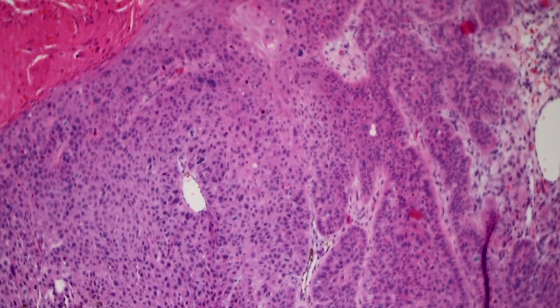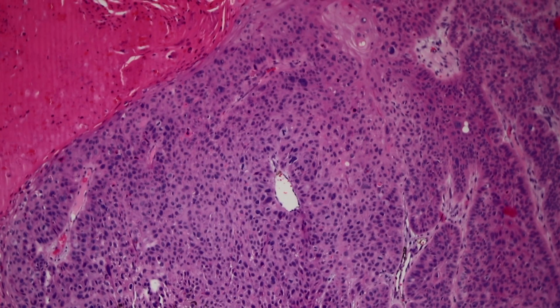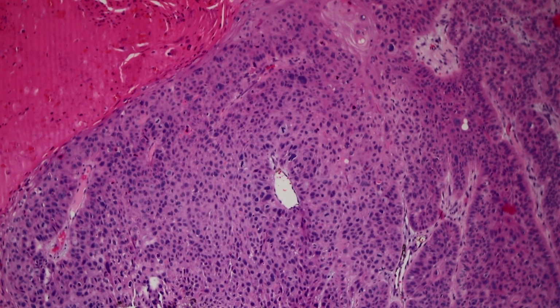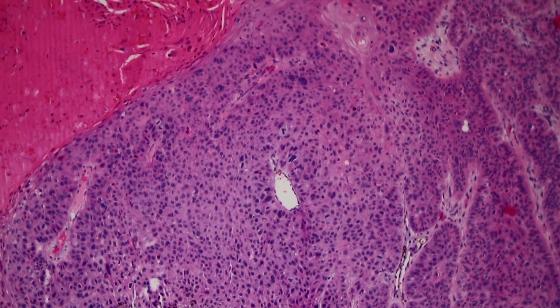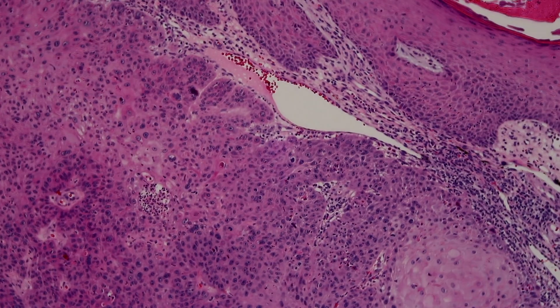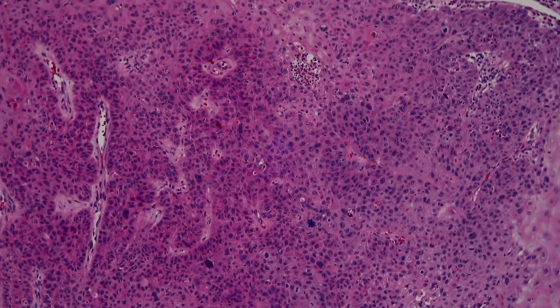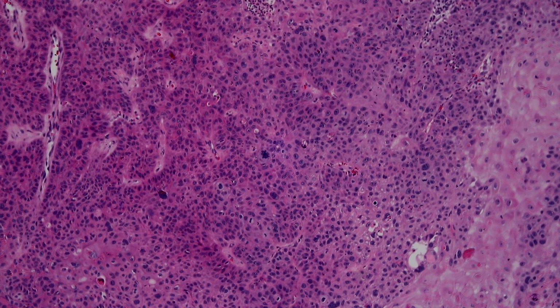And if you go right next door, you can see that obviously there's definitive squamous cell carcinoma here, no problem. But when I start getting really ugly sheets, but I can still tell it's squam, that's when I'll sometimes say, oh, there's moderately differentiated or well to moderately differentiated squamous cell carcinoma. I'm not totally sure if that has any definitive prognostic or behavioral difference, but again, I think it's worth mentioning. And also because if the tumor recurs or metastasizes, if there's uglier areas here that could be a little bit tricky, if only that area happens to spread or recur, then the next pathologist who sees the case may struggle to recognize it as squamous cell carcinoma.